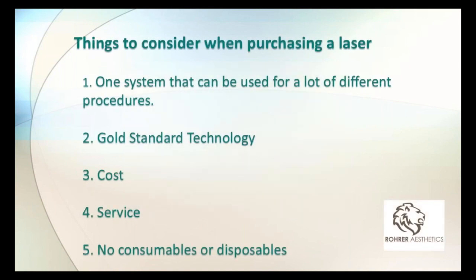So that pretty much sums it up. And actually, the other piece that our patient mentioned at the beginning of this that I had neglected to talk about: this procedure for the internal vaginal part of the treatment is completely painless. There is no anesthetic required. Now, treating around the introitus, or if you do any external treatment for the vulva, that requires some topical anesthetic, but it is remarkable how well tolerated and how pain-free this procedure is.